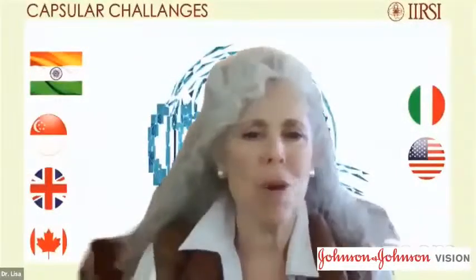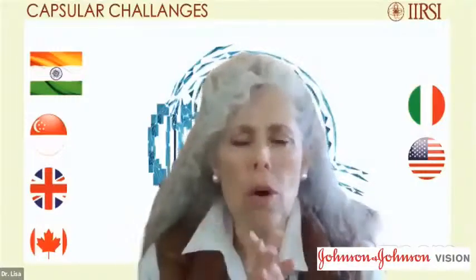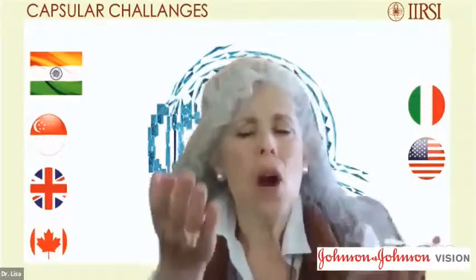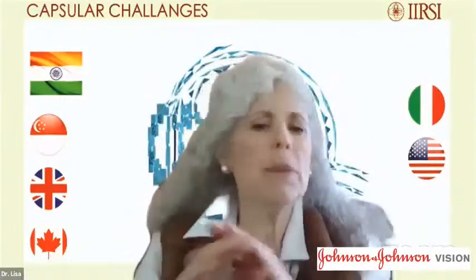I mean, there's so much more to discuss. Highest cut rate, the lowest, if you have a peristaltic machine, just a low AFR, 15 to 20. And then we want to balance our bottle or our infusion with our vacuum. So I like to tell people to have a panel set vacuum, go pedal to the metal, and then balance their vacuum so the eye is normotensive when you feel it.